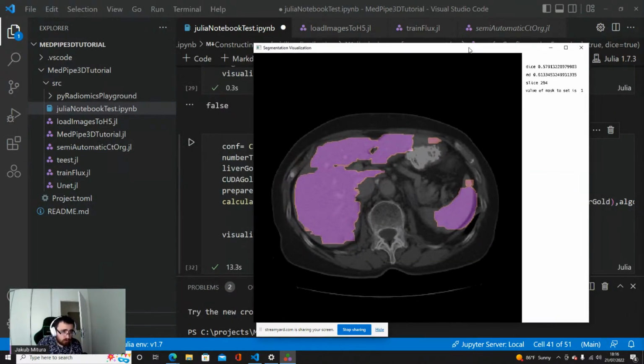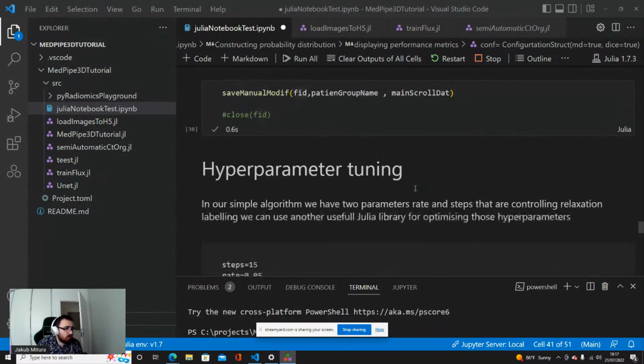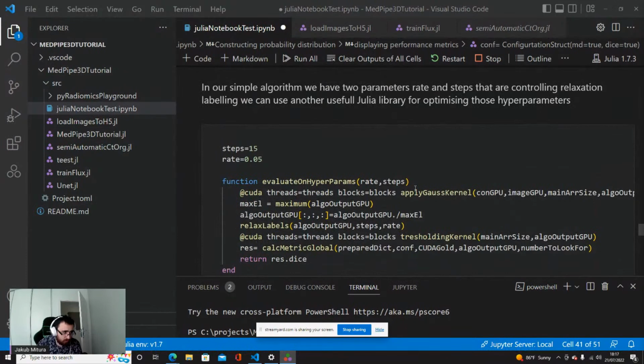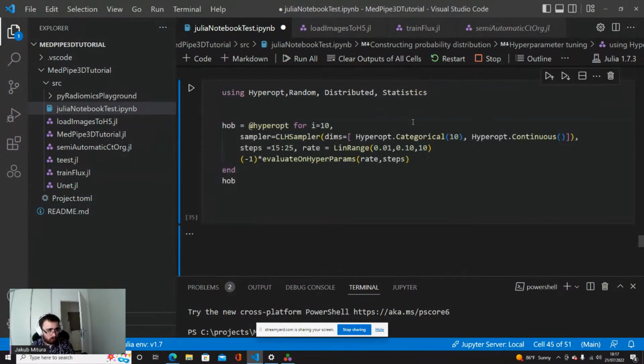Okay, so going on with this, we also have hyperparameter tuning. And how do we perform this hyperparameter tuning? In the case of Julia, it's really simple.